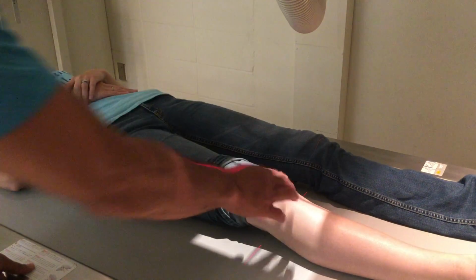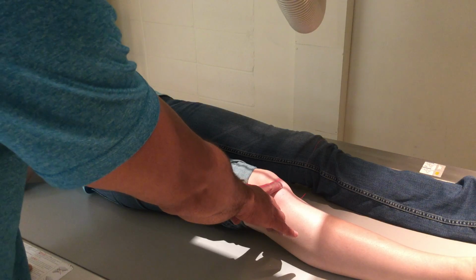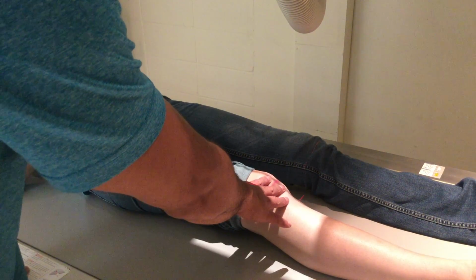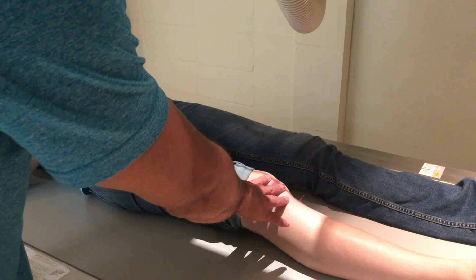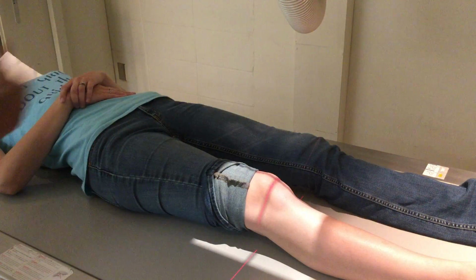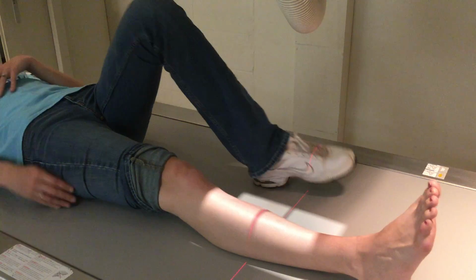So our tube and bucky are lined up. All we're gonna do is release the table and move her just a tad here. I need to move down a little bit. Because of the way I'm set up, I'm out of table range, so I need you to scoot up. There we go. Perfect. So now I've got some play here.